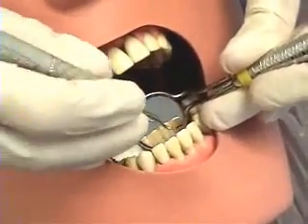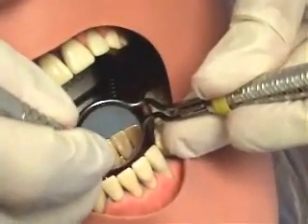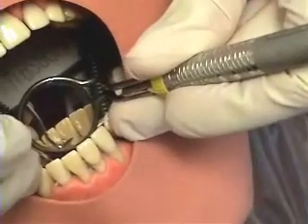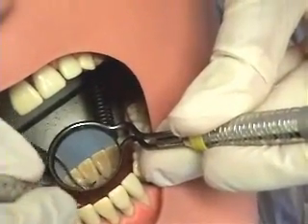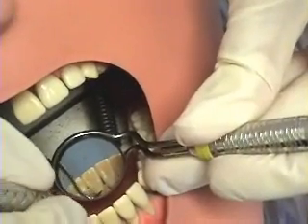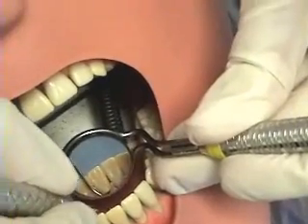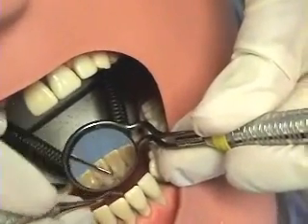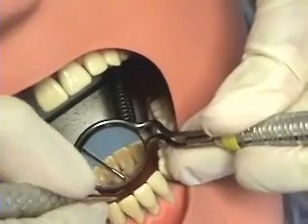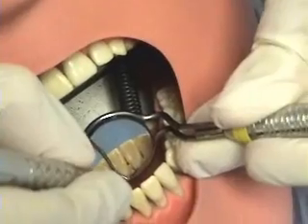The first instrument demonstrated is the anterior sickle. Right now I am using the straight end. It is used anteriorly in a short, controlled stroke, keeping that lower one-third in contact with the tooth at all times. You are using short, full strokes.